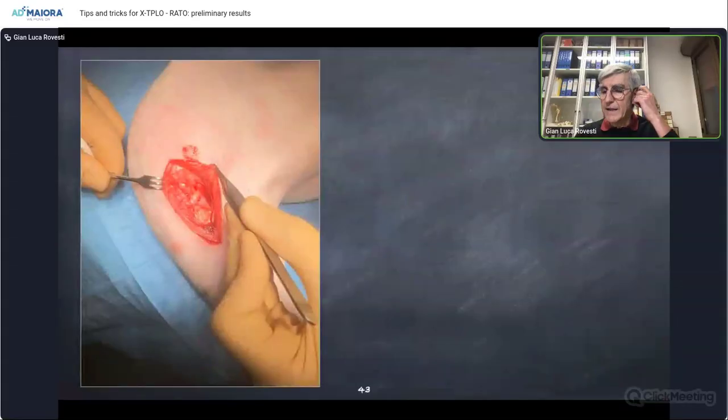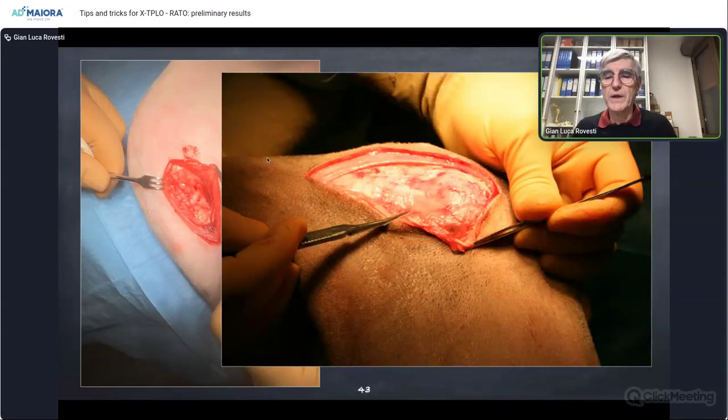We will start then with preparing the surgical theater, medial approach, the standard medial approach to the tibia. The group of muscles that we should recognize is the group of the tendons of gracilis, semitendinosus, and semimembranosus muscles, that were called by Slocum the pes anserinus group. It doesn't exist as a term in veterinary medicine, but they were called like this.